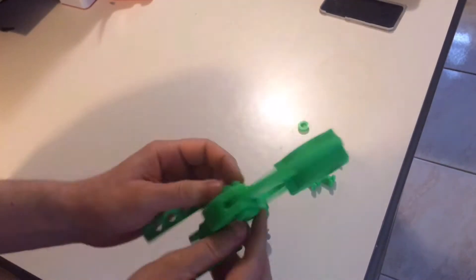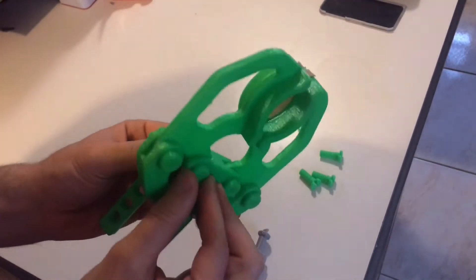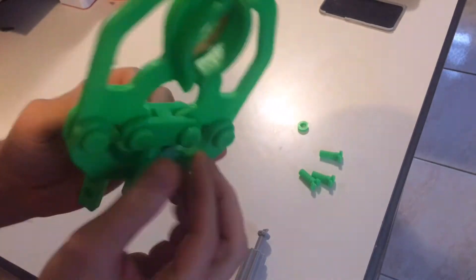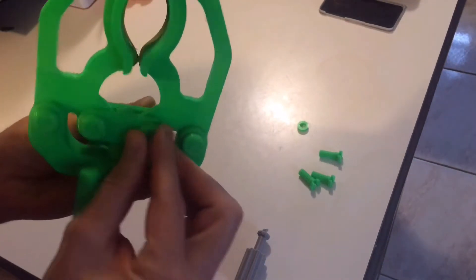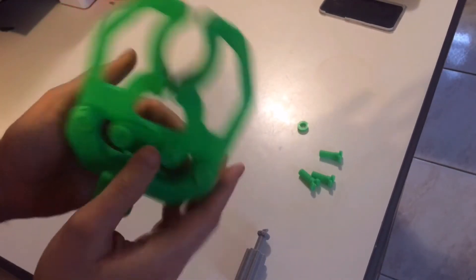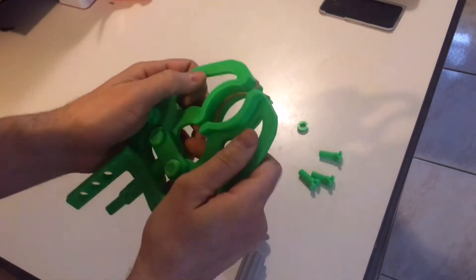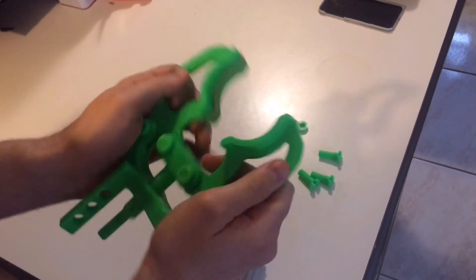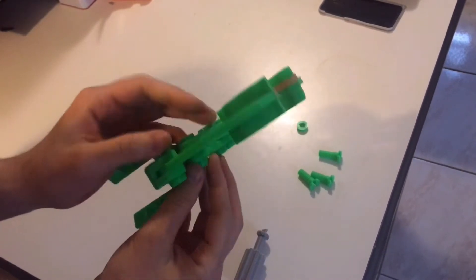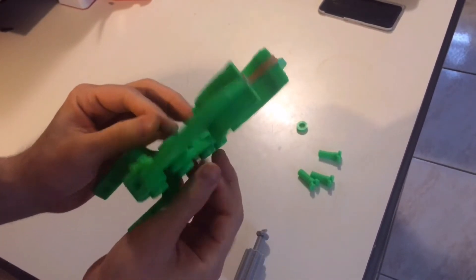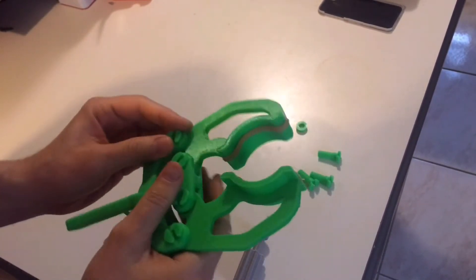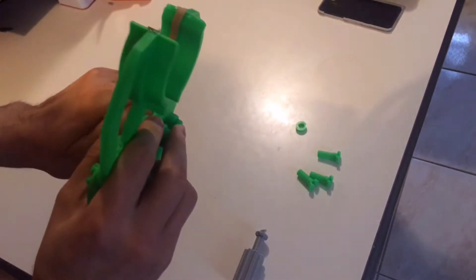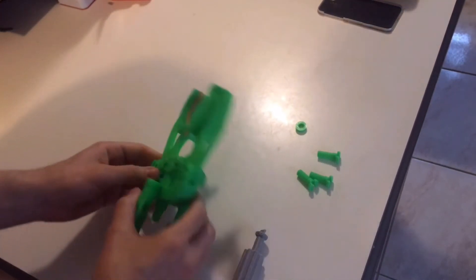The tighter you have it, of course, the harder it is to turn.